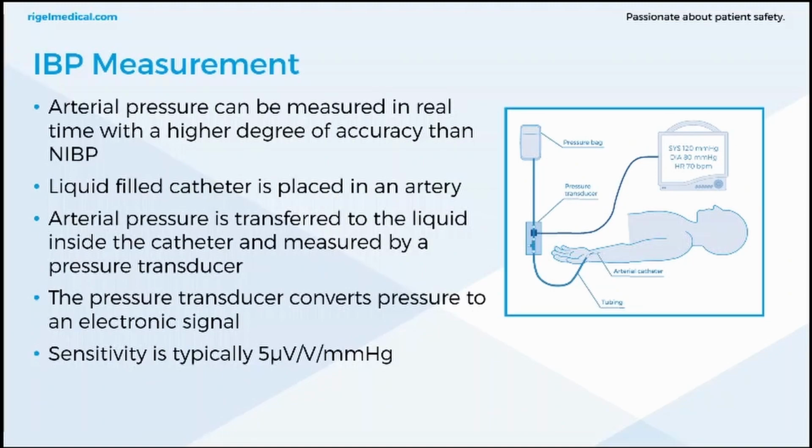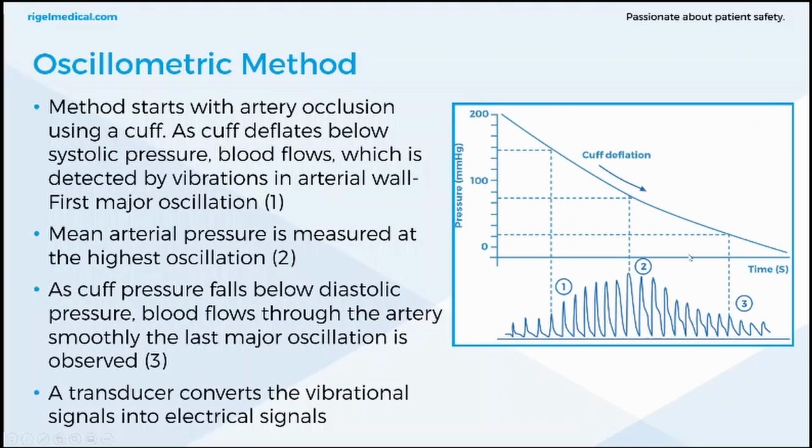So when a greater accuracy than NIBP is required, this is where you'll need a real-time arterial pressure. So this takes a bit of time as well. That's another disadvantage with NIBP. As you've all probably had at some point, either used an NIBP cuff within clinical engineering, or you've used it for personal reasons.